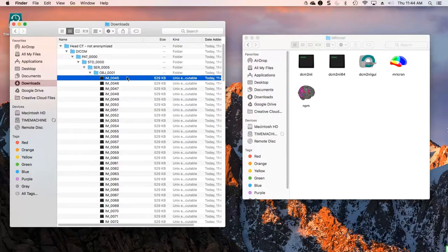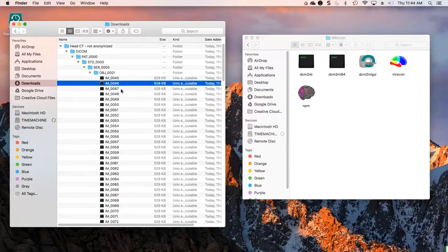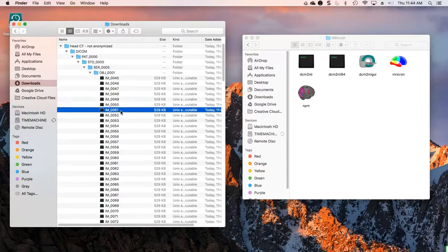Hello, my name is Justin Kramer and I'm going to talk to you in this video about converting medical imaging DICOM format into an anonymized NIFTI format. The benefit of this is obviously anonymization allows you to distribute the files without any concerns over PHI, and converting it to NIFTI takes all of these different files that make up a DICOM imaging study and puts it into one single file, making it a lot easier to distribute and to identify which file corresponds with which imaging sequences.